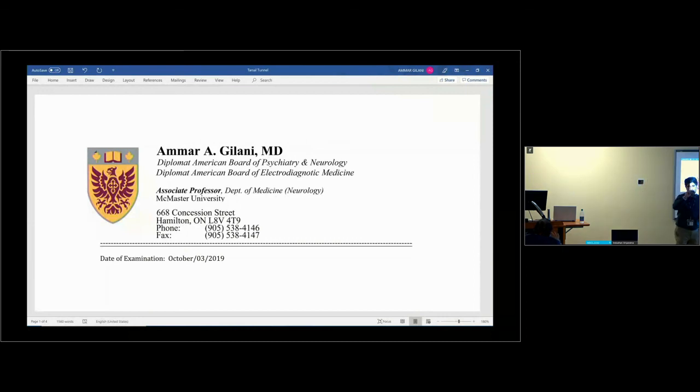When you are doing a conduction, we do supramaximal stimulation. So basically, you're stimulating every single fiber in that nerve. Now, when you get the action potential, the initial deflection latency is determined by your biggest fibers. So for the biggest fiber, velocity is close to 100. If I go to 5, it's 25. It's usually about 5 times the size. And if you're going to 1 or 2 micrometers, it's 10 meters per second. So they are completely missed out.